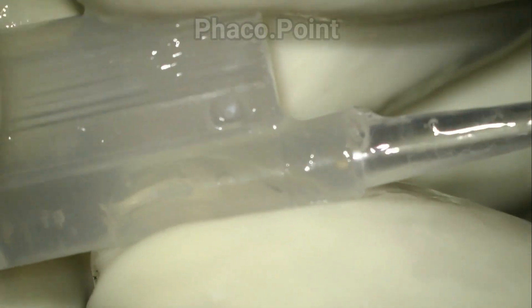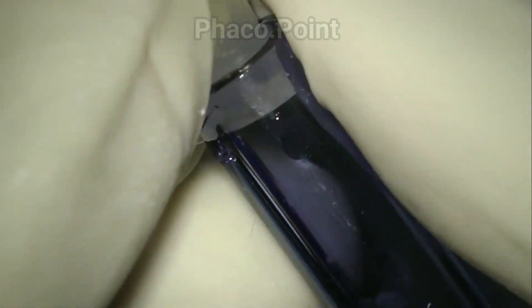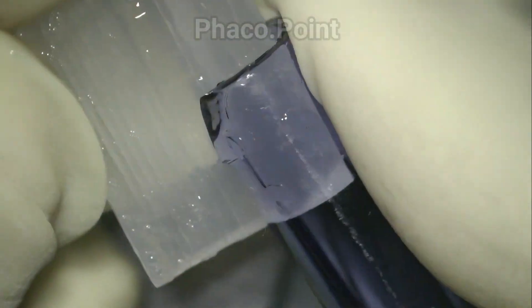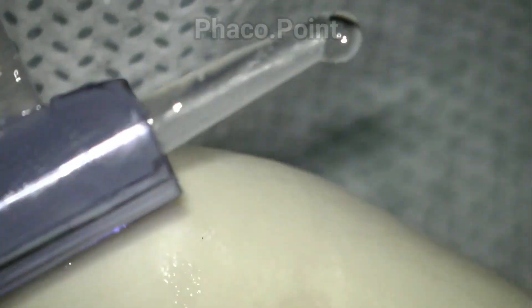The surgeon increases the magnification and visualizes very carefully to ensure that no part of the IOL is stuck within the cartridge. Having done that, the cartridge is introduced into the injector and snapped into its position.